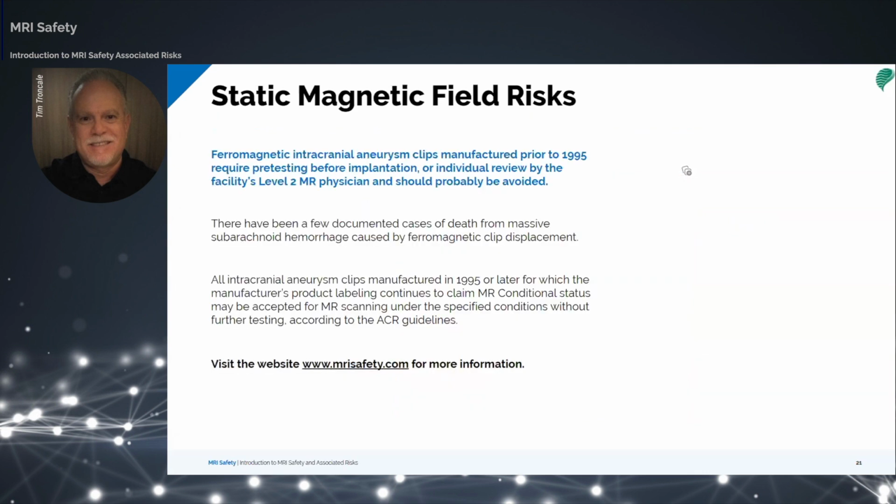For more information, check MRIsafety.com or the MRI Safety Manual published annually by Dr. Frank Shellock. In addition, patients with implants may have a card with them with the make, model, and serial number of their particular implant, but unfortunately, not enough patients carry these with them. If they happen to have one, this number can be checked at the manufacturer's website for MRI safety information.